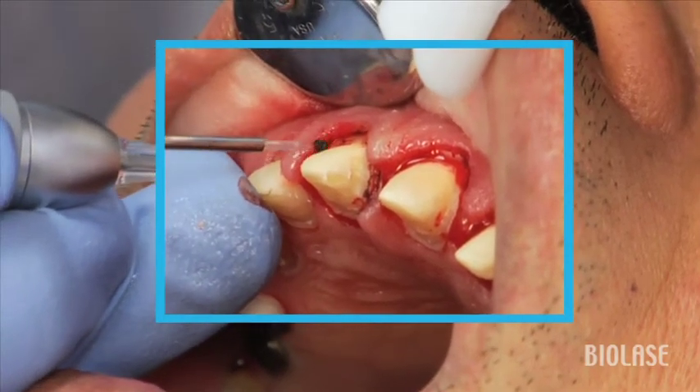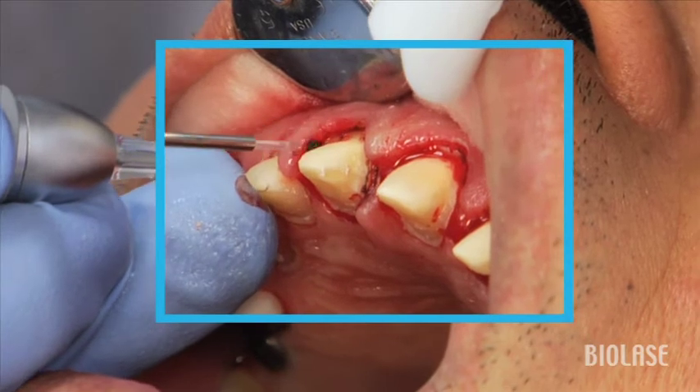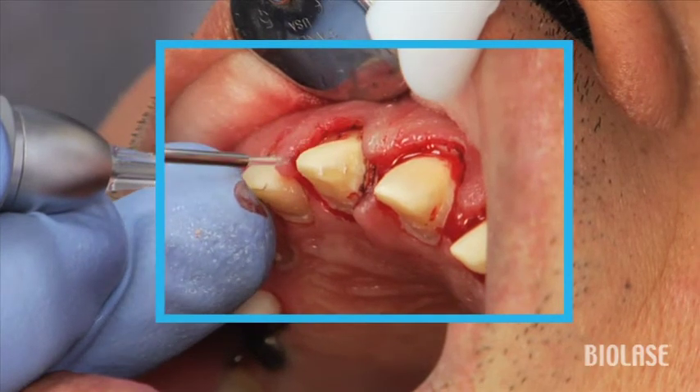Secondly, don't go too deep. What we want to do is go only a millimeter to a millimeter and a half into the sulcus depth. If we go too deep, the tissue may end up collapsing upon itself, covering the margins which we were trying to expose in the first place.